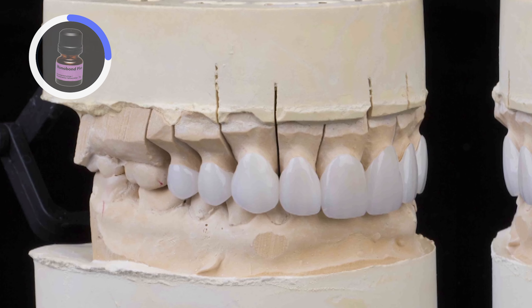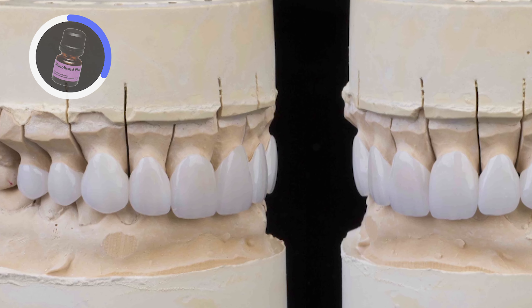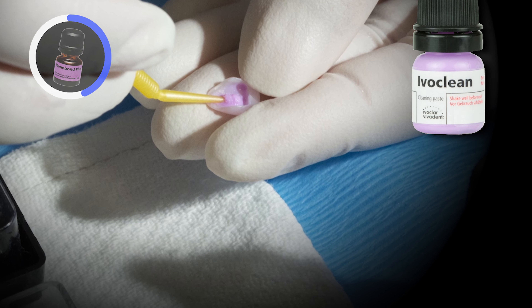Once the teeth have been etched, a thin layer of gluma is used as a desensitizing and antimicrobial agent. I allow the gluma to sit on the teeth for at least a minute, allow it to soak in, and then remove any excess with a dry microbrush.